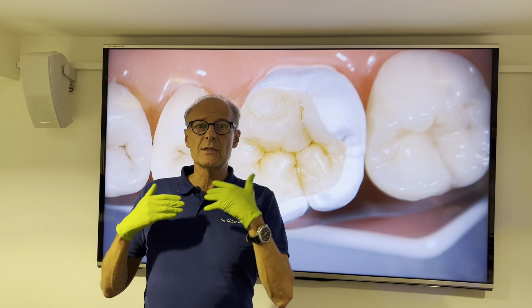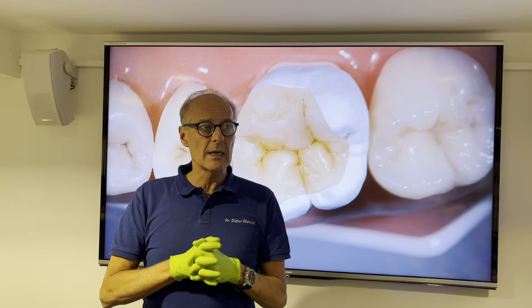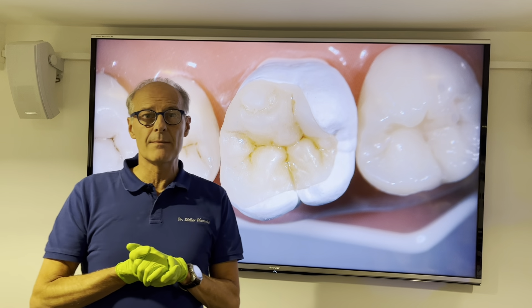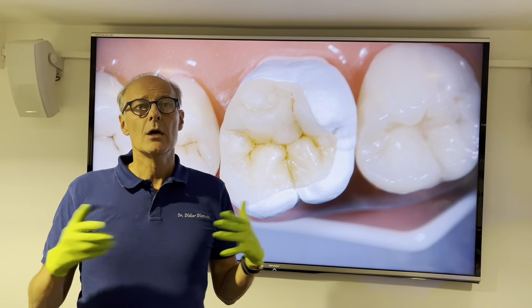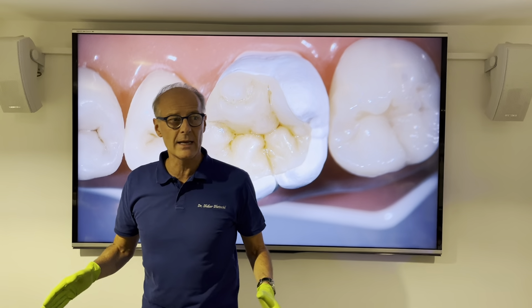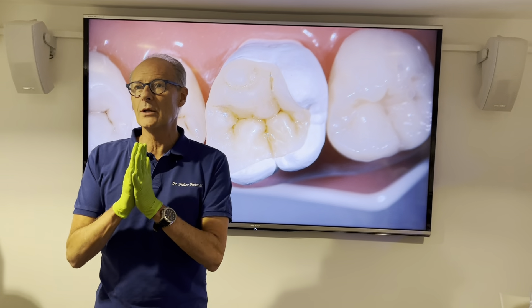The idea of this exercise is to train once again the sculpting technique and anatomical skills so that we can produce amazing, beautiful direct restorations. The group has been really amazing — thank you everyone, you did a great job.